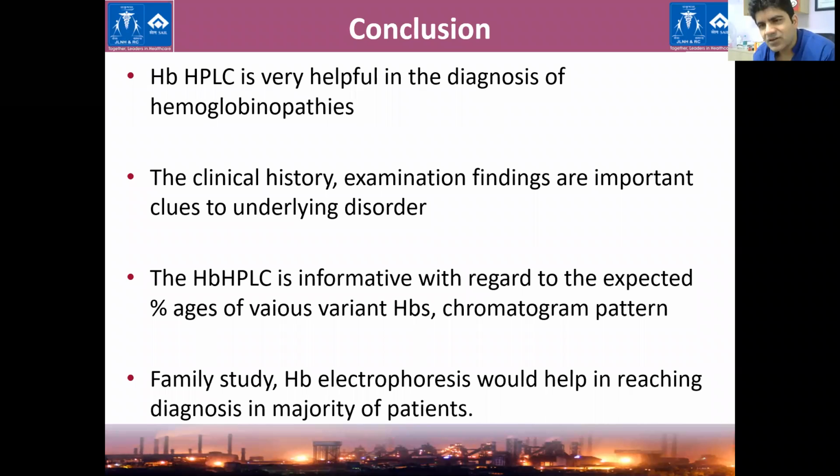Now, what are your comments on neonatal screening HPLCs which are done these days? We did it at that time, and somehow we got results, but I personally think that it's not needed, because we can do it at a later age. It won't differentiate thalassemia major.